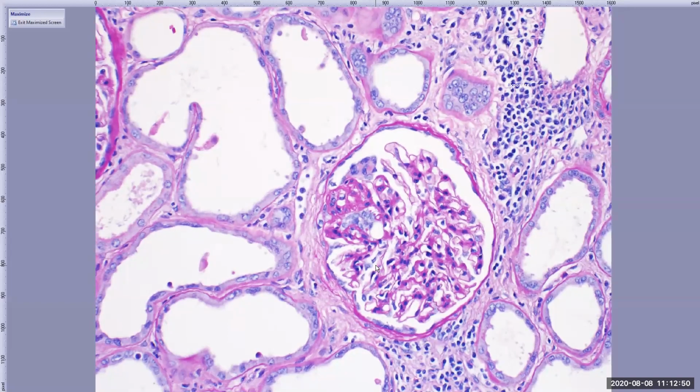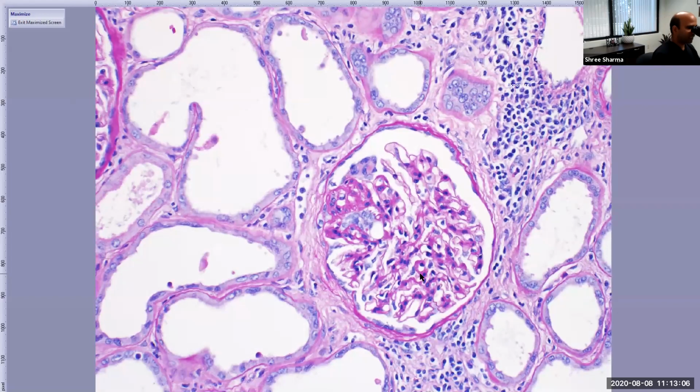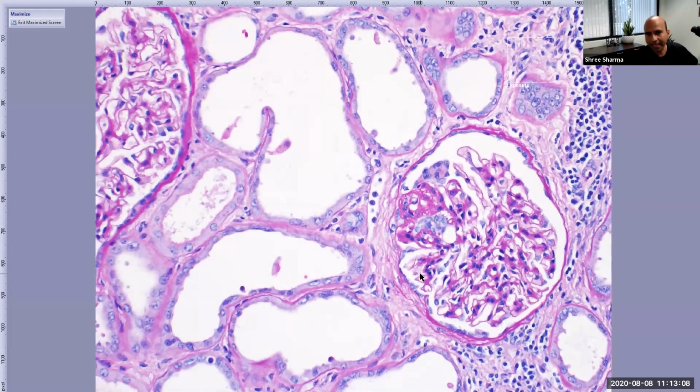Okay. So when we understand the morphology of a lesion, as you said, there is some pink material, which we are calling a matrix. There are some cells. So how should I explore more about that morphology? That is one way I can see as I go forward and explore different lesions. What is the extent of this pink material? What are the cells where this adhesion is present? Right now, I'm not sure.